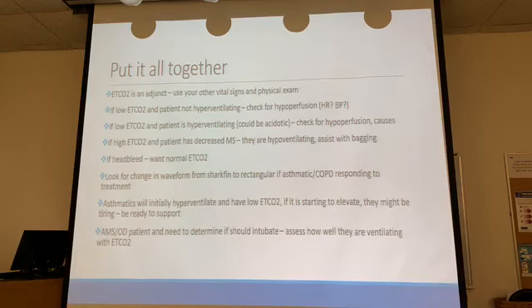And if they're hyperventilating, remember what I said, who hyperventilates? Your acidotic patients, right? Your DKAs, your aspirin overdoses. Look for potential causes, check a finger stick, what's your sugar? Oh my God, his sugar was 800. No wonder he's breathing so fast. I need to make sure he keeps breathing this fast, because if he stops breathing this fast, that means his pH is going to get more acid. I know I keep telling you guys not to associate it with acidosis, but hyperventilation, why do they hyperventilate? Because they have some acid buildup. So, you know, don't get too deep into the woods with it, but kind of learn the basics.